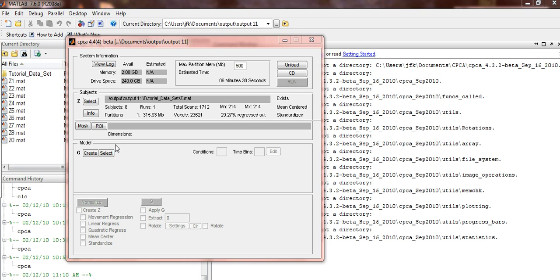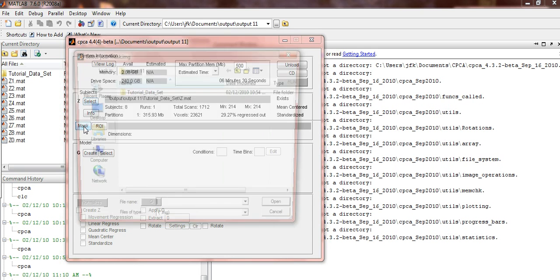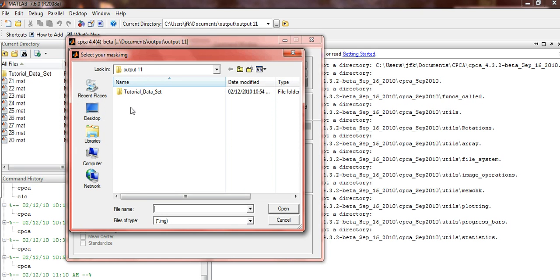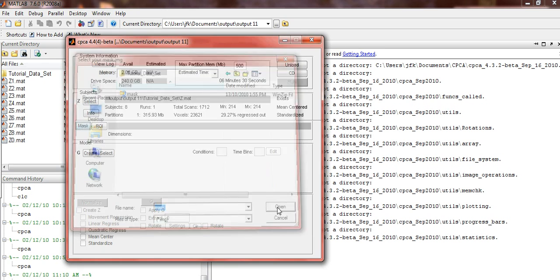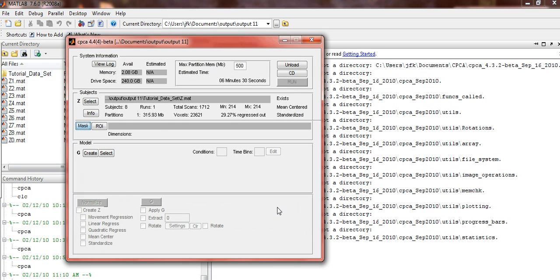Now you're ready to load your mask. Click on the Mask button. Once it's loaded, you should see its dimensions listed here.